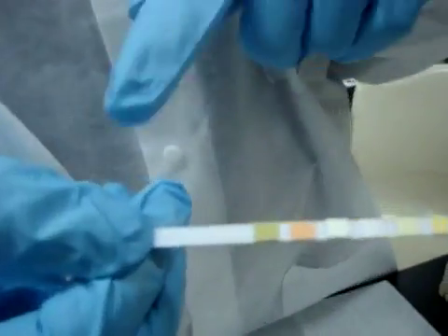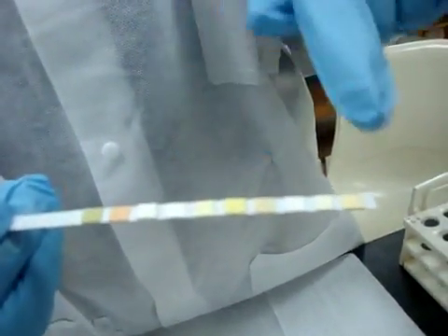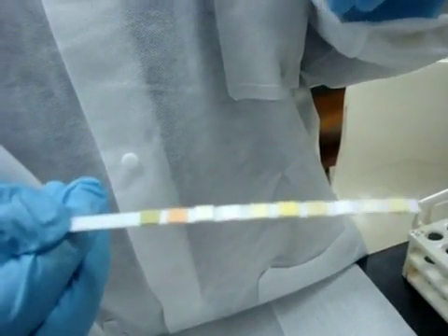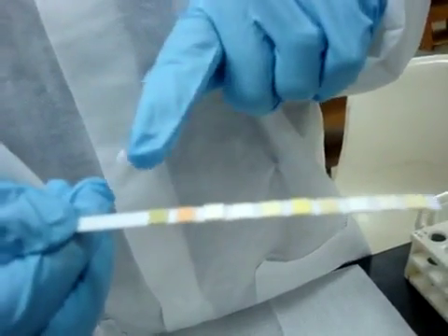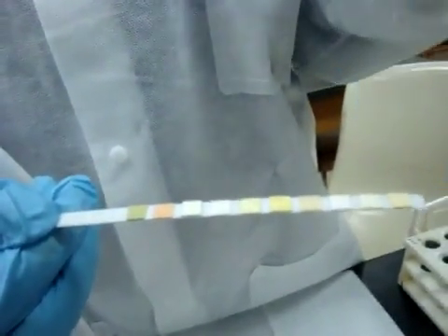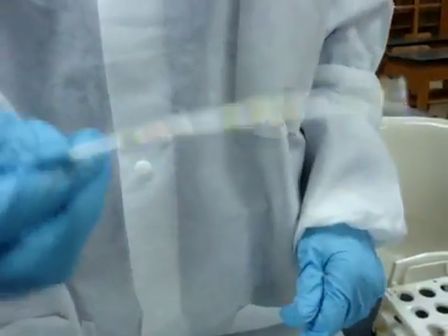If we look at the strip, we will see that there are little square pads, and each one of these pads contains a chemical. Now, as we do our discussion on the chemical analysis of urine, you will find out what is on every pad and the chemical reaction of every pad, the reagents on every pad, and the colors that they will turn. But this is your dipstick.